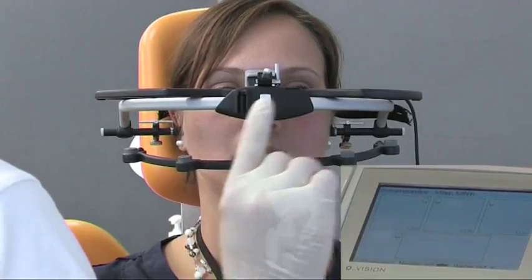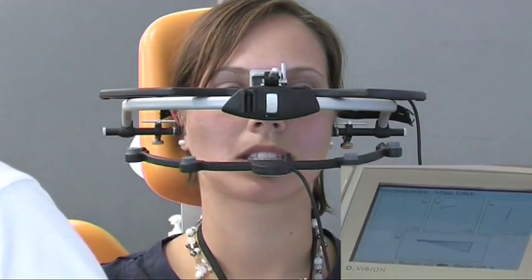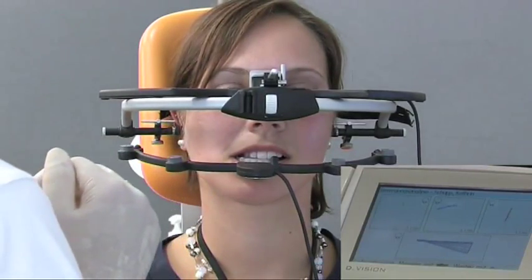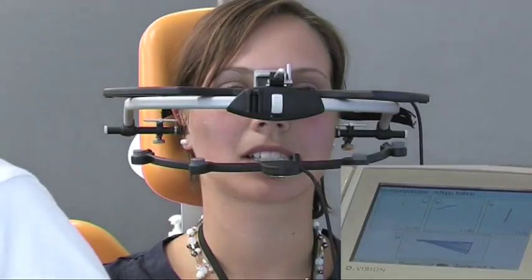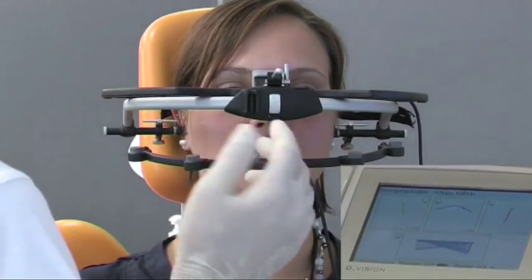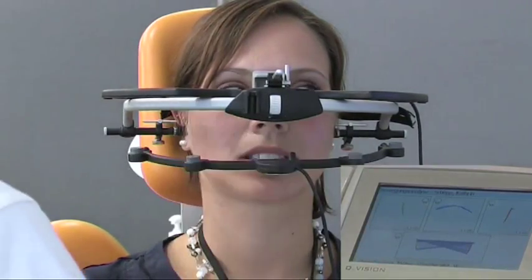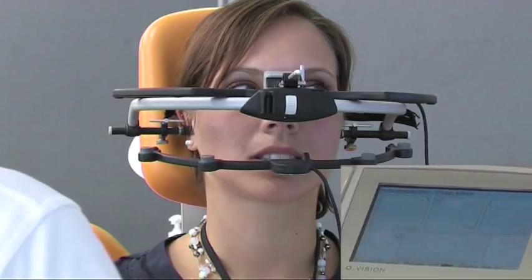Now the lateral trusion movements, left and right, are recorded. Please move the lower jaw to the left, return and bite down normally. Now to the right, return and bite down. This data is also stored.